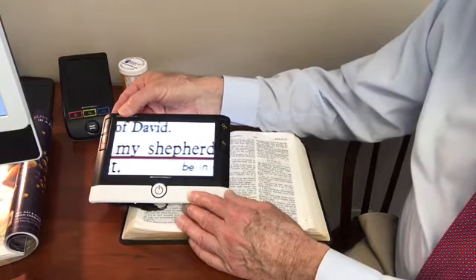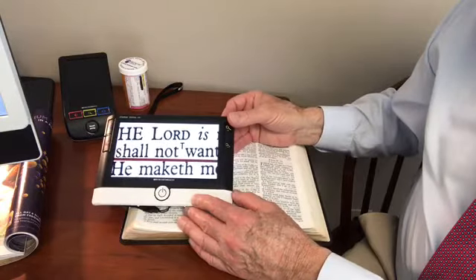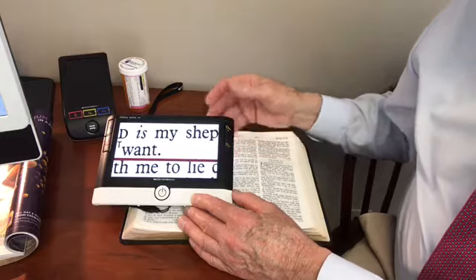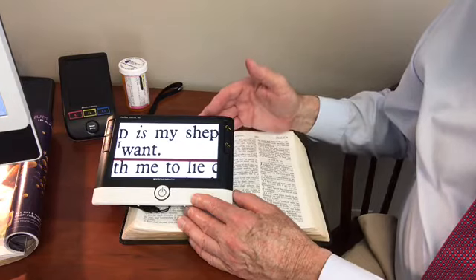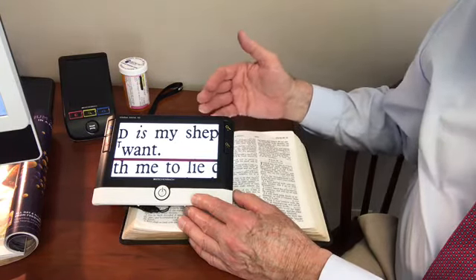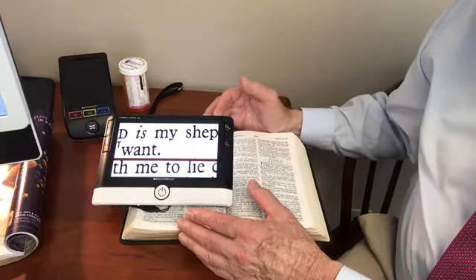Then, by pushing the button here, you go back to the beginning, drop down to the next line, and work your way across that — a very nice feature. In addition to that, for maximum magnification, this can actually be connected to a computer monitor or a television set, so what is seen on the screen here would be magnified tremendously on the TV screen.